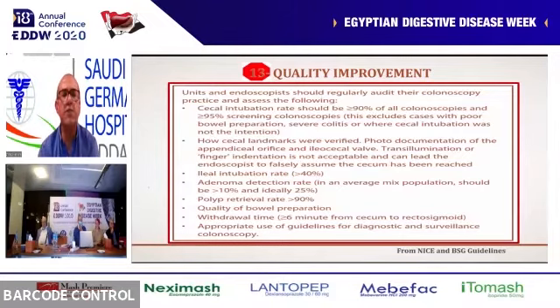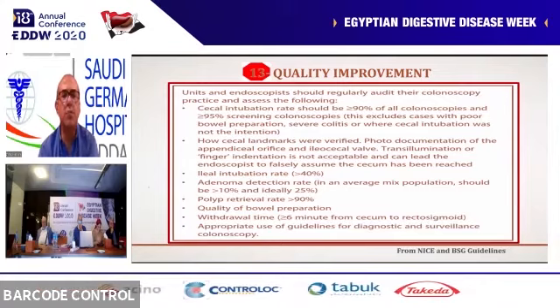Polyp retrieval rate should be more than 90%. Quality of bowel preparation is important. Withdrawal time should be more than 6 minutes, with appropriate use of guidelines for diagnostic and surveillance colonoscopy.